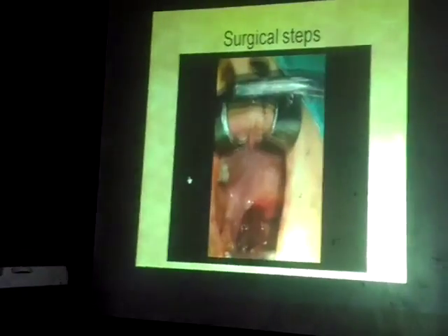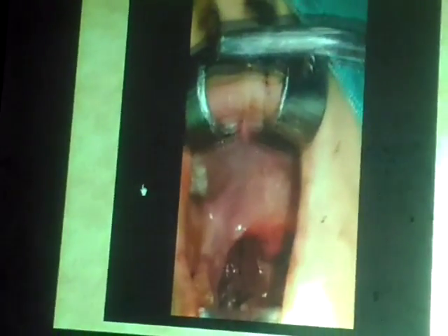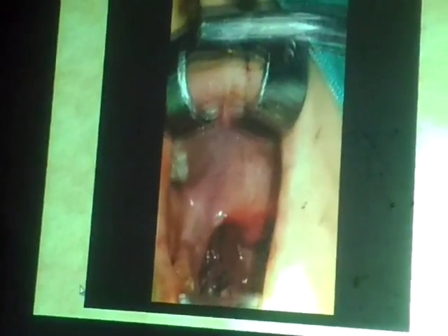First I cauterize, then I put ephedrine back, and then I will put hydrogen peroxide, and then I will suck from the nasopharynx, and then I will put the decongestant nasal drops to make sure before the patient is awake that there is no chance for the patient to have post-adenoidectomy bleeding. Of course, nothing is 100% guaranteed, but I think doing the adenoidectomy in this way will keep you to some extent safe.